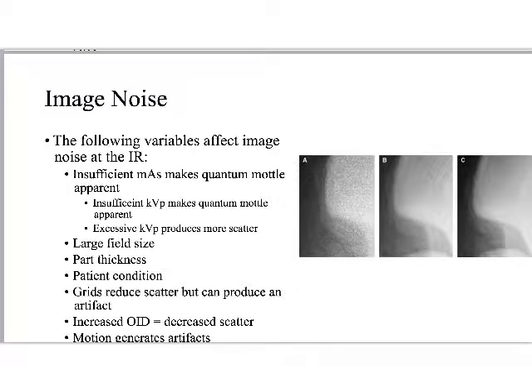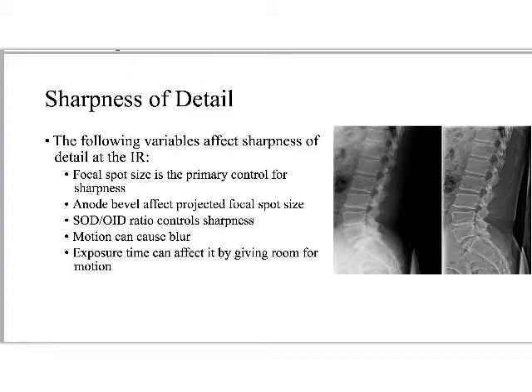And then finally, to talk about things independent of technique, motion can generate artifacts, right? So it's a geometrical kind of noise, the motion artifact. Okay, sharpness of detail.